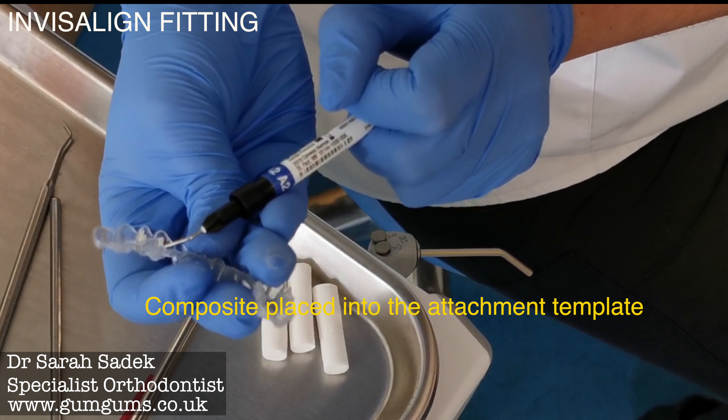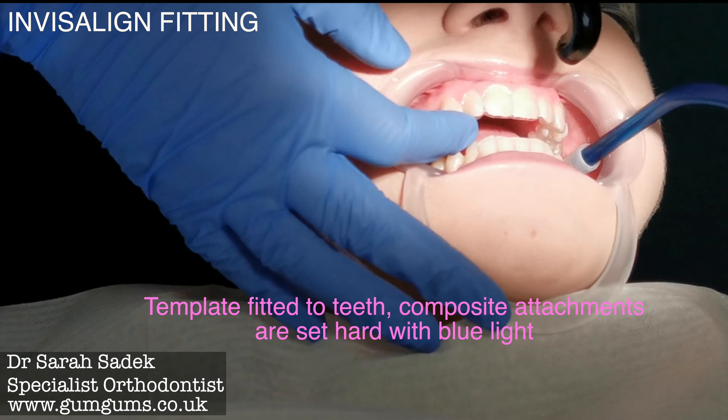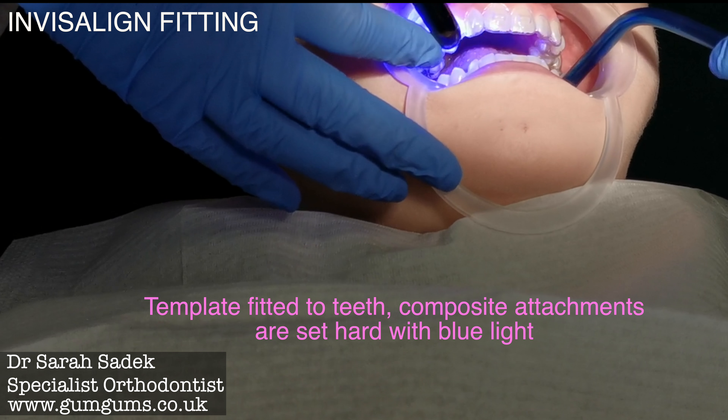Composite is then placed into the attachments on the Invisalign attachment template. The template with the attachments are fitted to your teeth and set hard with a blue light. In some cases, filing in between your teeth may also be necessary during this first appointment. However, this wasn't necessary for my patient today.